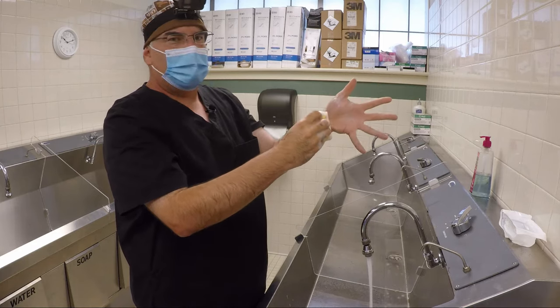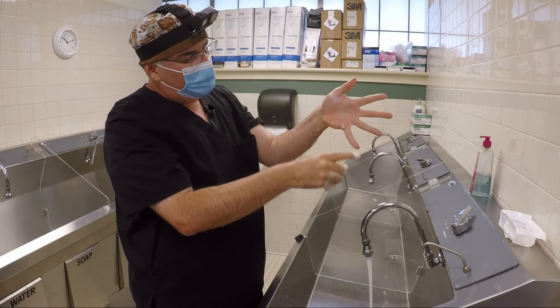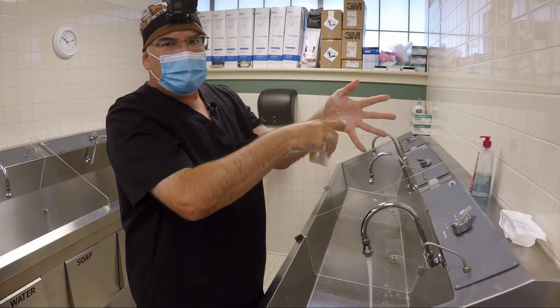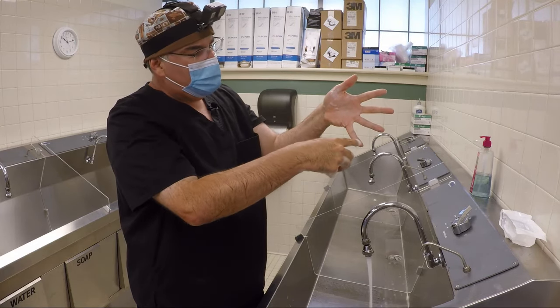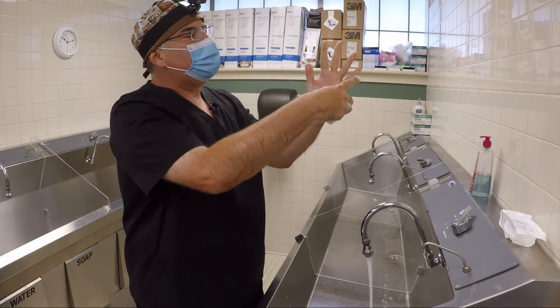Now I did something there. I don't know if you noticed. I dipped my hand down a little bit. See how my pinky's going here? That means if any of the water or anything here, this is dirty, it's going to run down my pinky. That's not good. We don't want to do that. We want to make sure that that stays up.